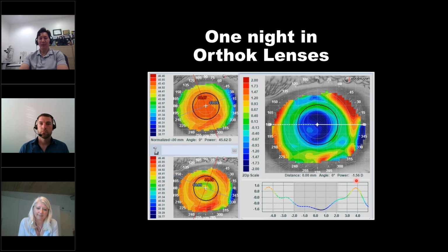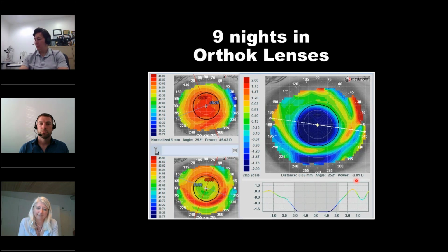And then after 9 nights, you notice that pupil filling in significantly, and it really alters the whole corneal surface. As Mette described, we're going to smooth out and sphericalize that cornea. And that axial power change should become 1-to-1 with the refractive change after full effect, which we know is 7 to 10 days.